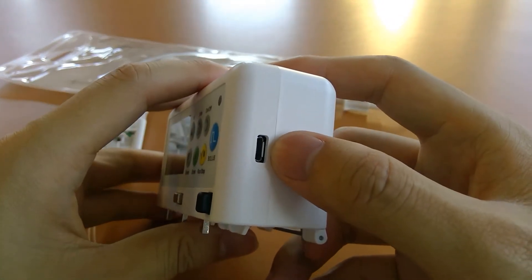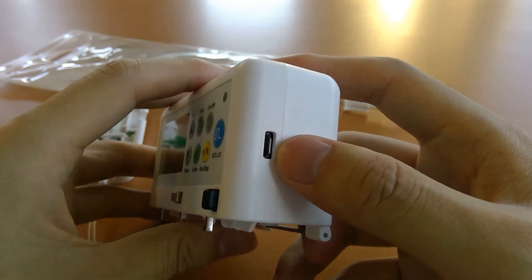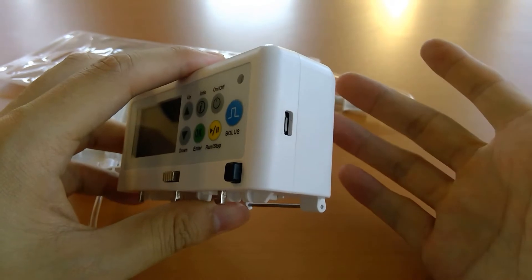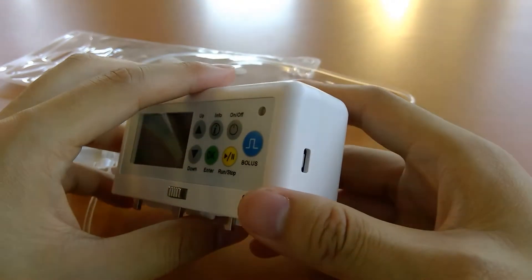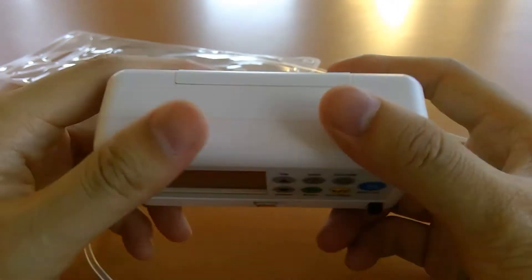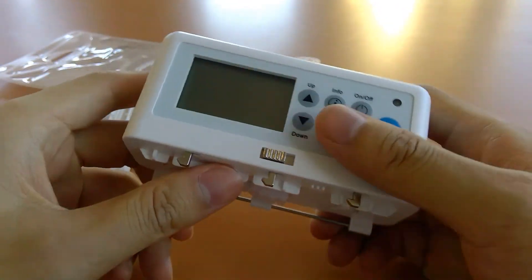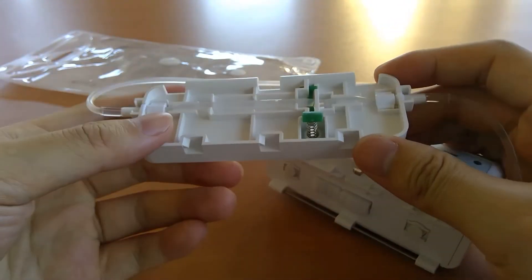The micro USB port on the side is able to power the pump externally. We have a certified wall adapter that can power the pump, but most power sources work and you can use that as backup. From here we can also go over the set.